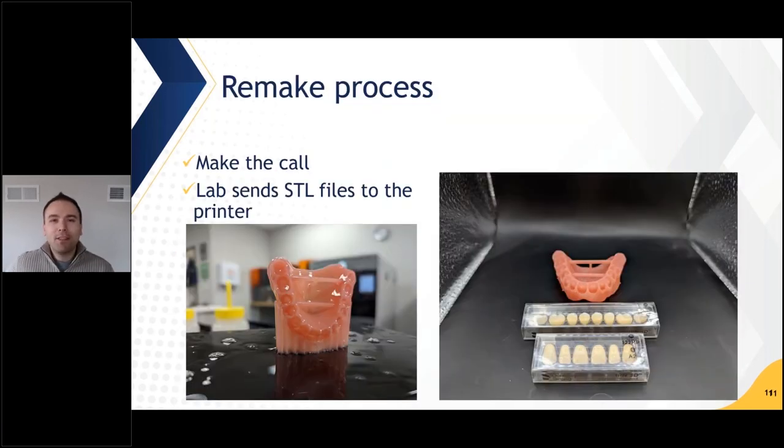So the remake process goes like this. You make the call, lab sends the STL, and you're done. What do I mean by that? There's a digital record of the denture that you've designed, and there's also a record of the carded tooth setup that was used for that particular denture.